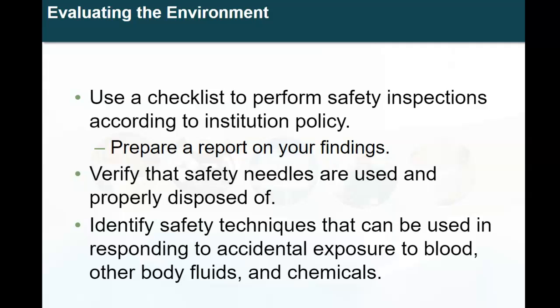You want to verify that safety needles are used and properly disposed of. When we get into phlebotomy, I will teach you what a safety needle is and how it differs from the olden days when we used to just have needles that didn't have any safety device on them. So basically, a safety needle has a clasp on it that you push up to dull the edge of the needle so that you can't stick yourself with it. It closes the needle off. That's what that's referring to.